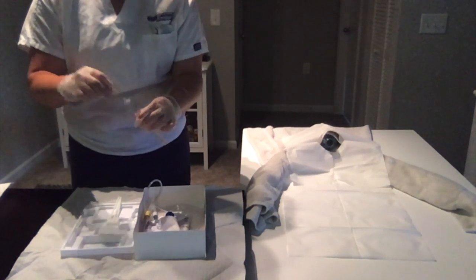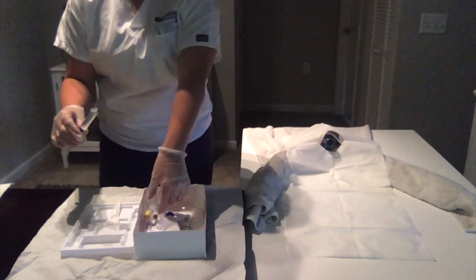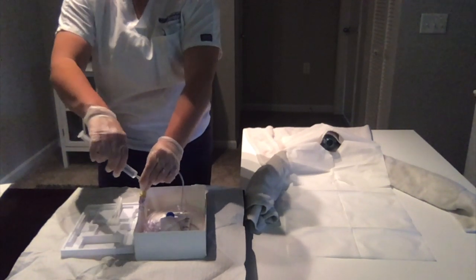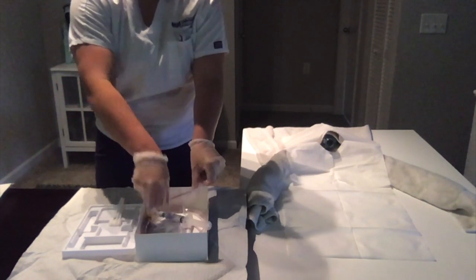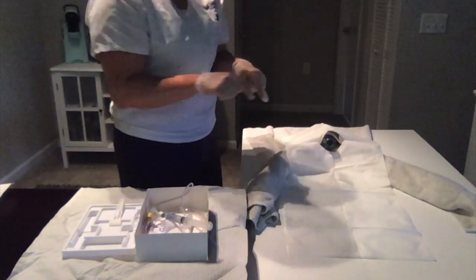I'm going to take this cap off. I can drop it over here, drop it in my trash, just maintaining the waist level. And then I'm going to hook it on to my catheter and make sure that it's on and everything is in the box. Okay, then I'm going to move my set over to the field.